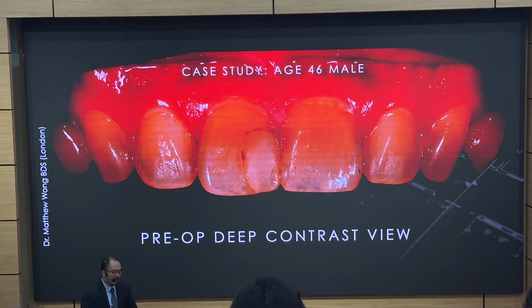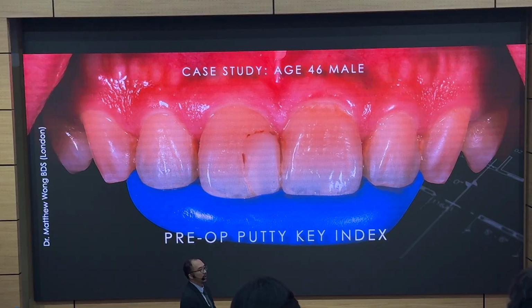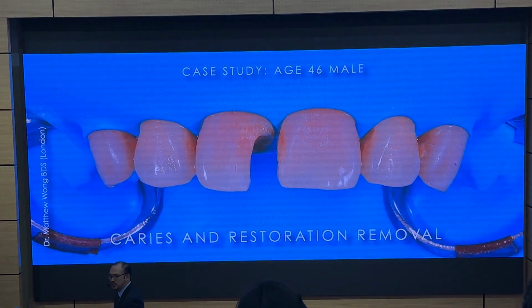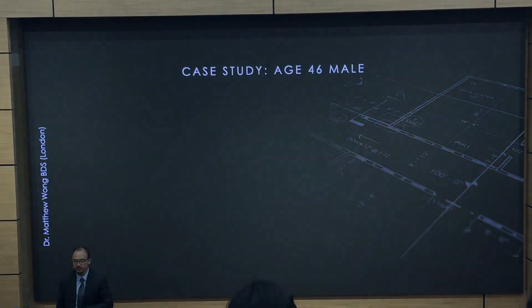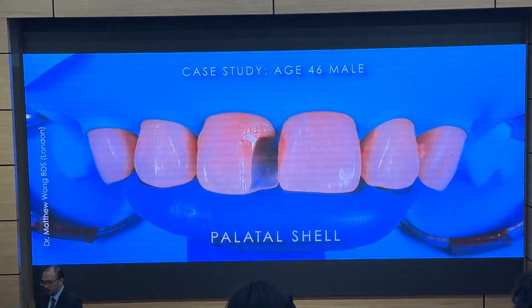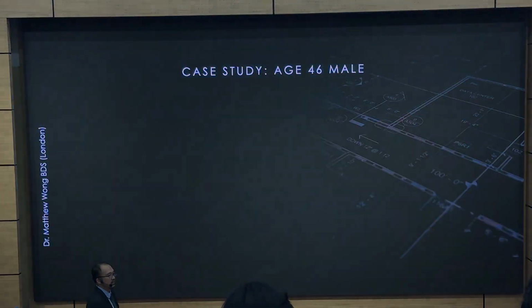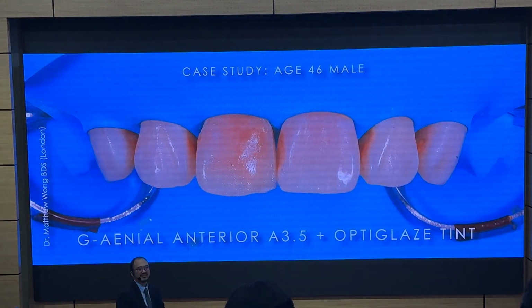So, another thing that I do want to highlight is the fact that we always underestimate the effects of dehydration. This is a case that we have done a while back. I know this is a hard case because this patient had quite bad tetracycline staining. When we build this tooth up, it's the same steps that we have gone through. I'm not going to go through this in detail anymore. But one thing that you're going to notice after the filling is done is that it's going to look quite bad.